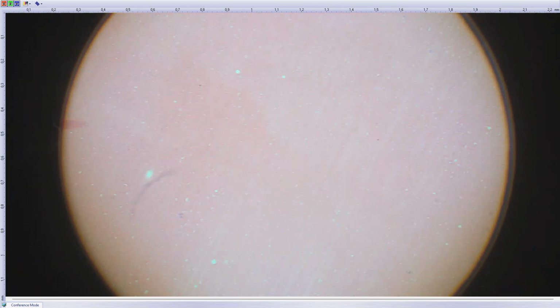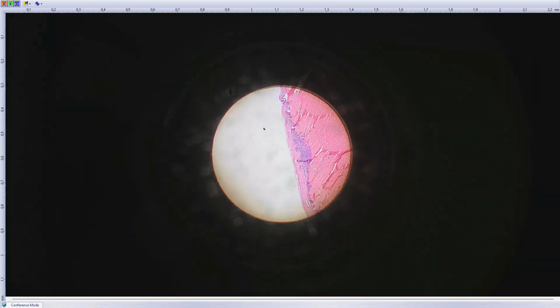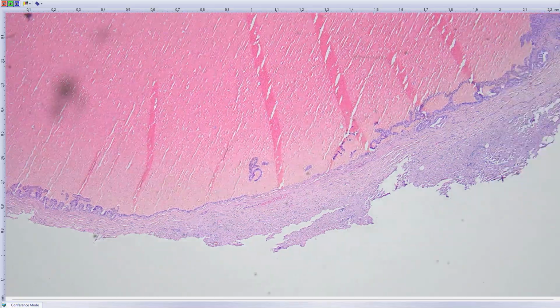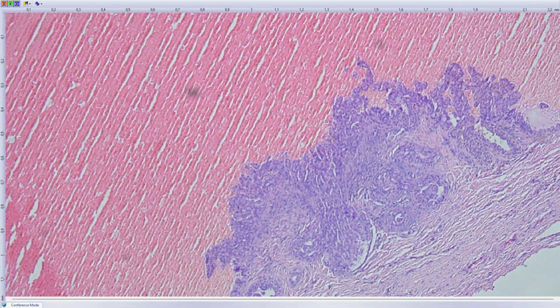Next I have here a simple thing, it is cystic lesion of vulva. And you see it is just a big cystic lesion. Someone would like to say it's a cyst, simple cyst, but I think that it's not only a cyst, because you see epithelial proliferation at the wall of the cyst.